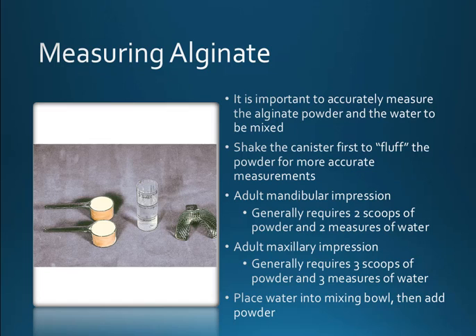Okay, next let's talk about measuring the alginate, because this is a critical component as well for taking quality impressions.